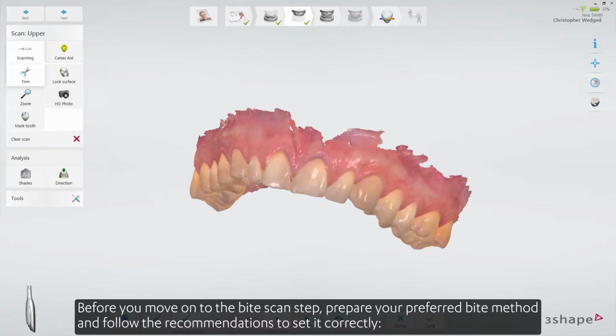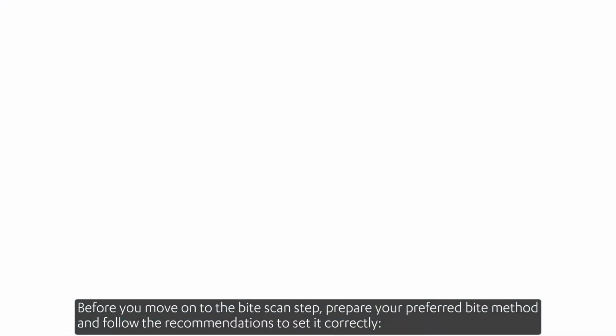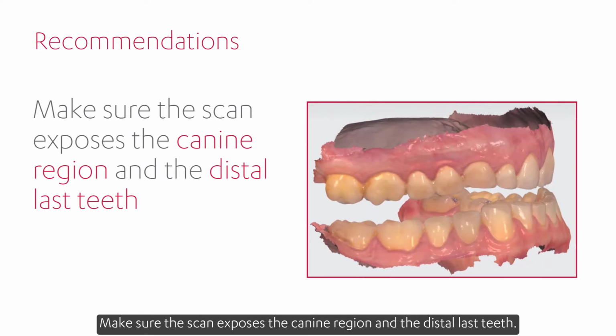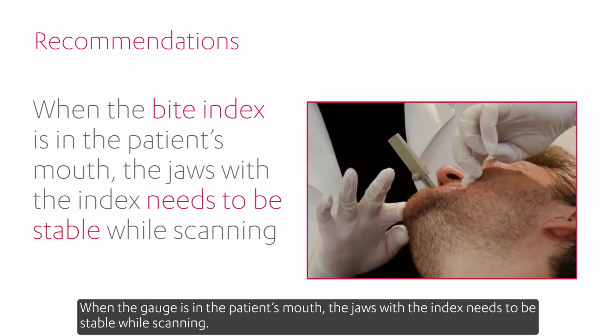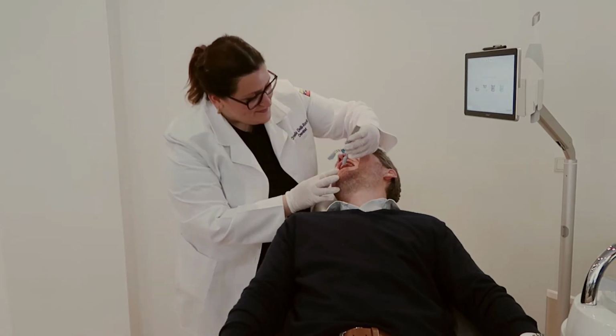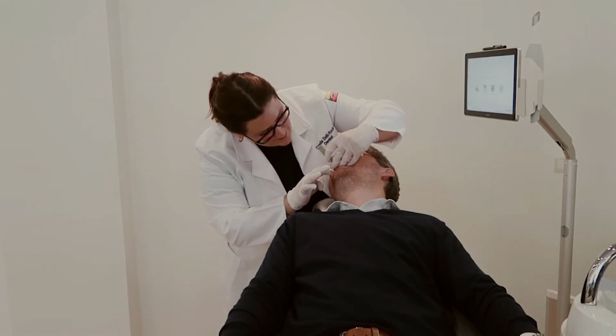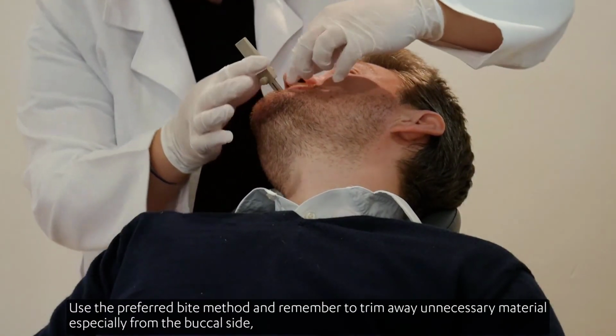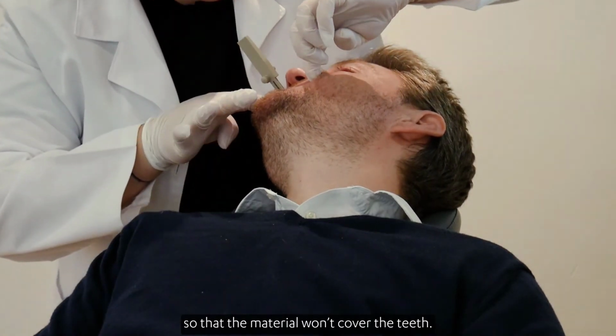Before you move on to the bite scan step, prepare your preferred bite method and follow the recommendations to set it correctly. Make sure the scan exposes the canine region and the distal last teeth. When the gauge is in the patient's mouth, the jaws with the gauge need to be stable while scanning. Use the preferred bite method and remember to trim away unnecessary material, especially from the buccal side, so that the material will not cover the teeth.